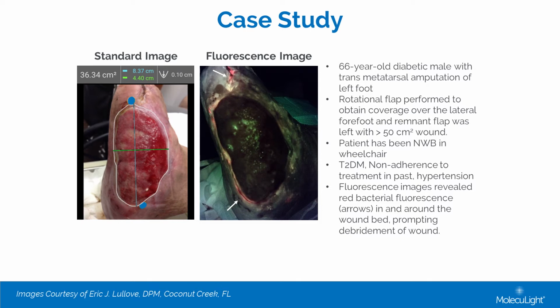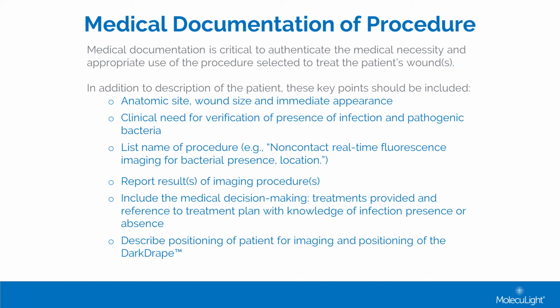And as a result, it prompted me to do further debridement and do better edge effect debridement on this patient, not only on this visit, but also in subsequent treatment visits. So in order to document the procedure properly, because it is a procedure, you want to have a very good description of what you're doing.